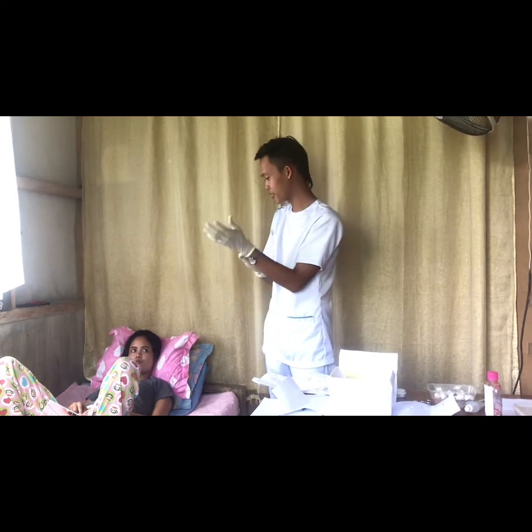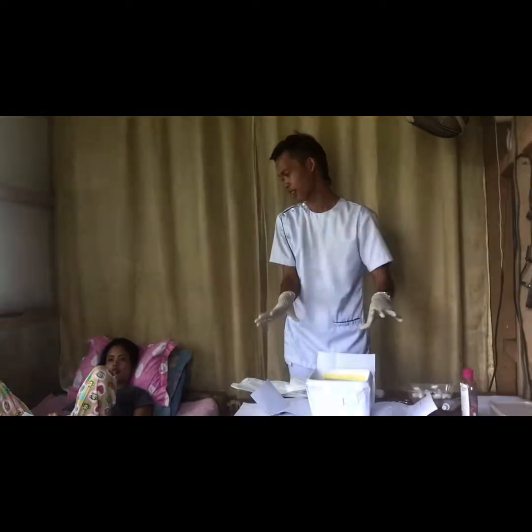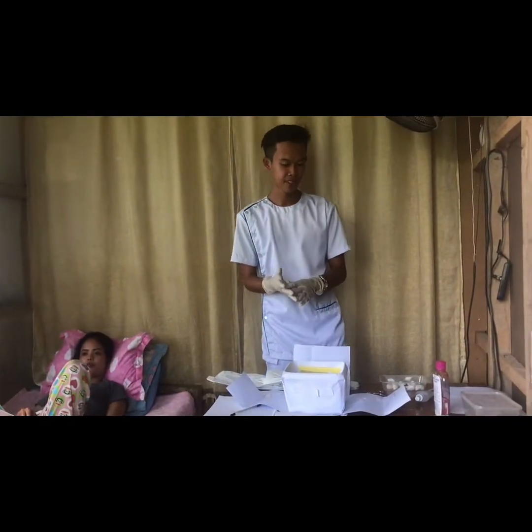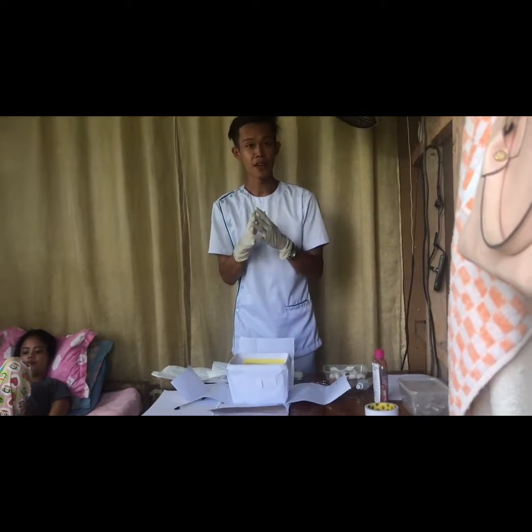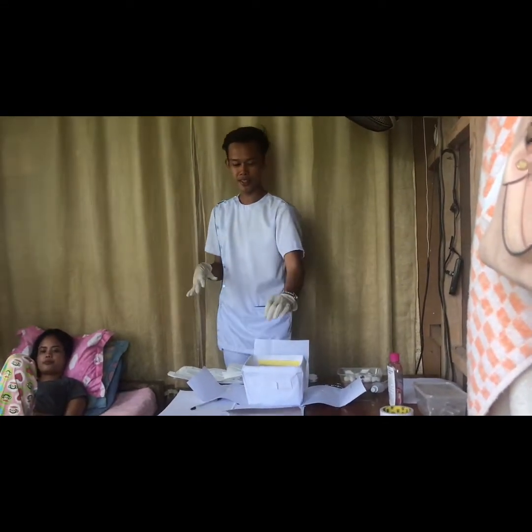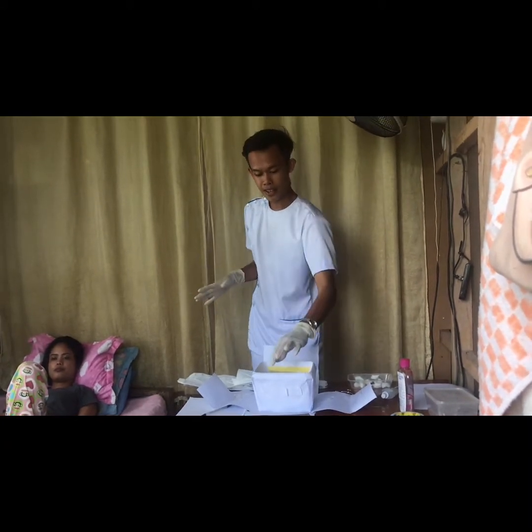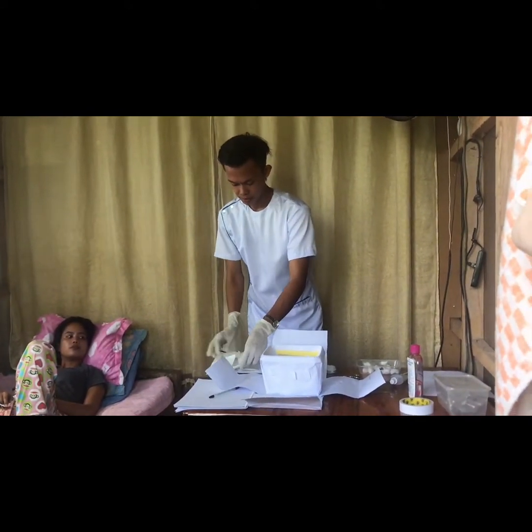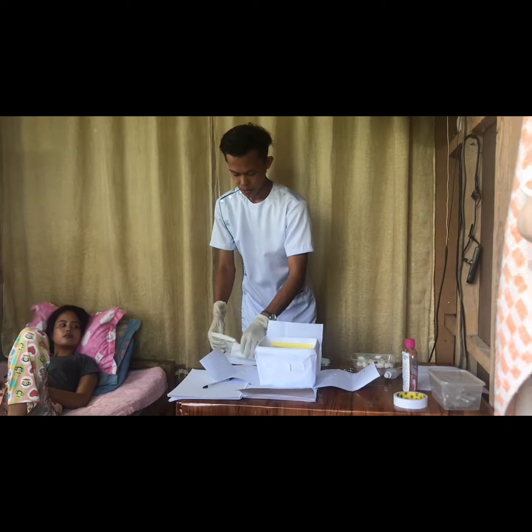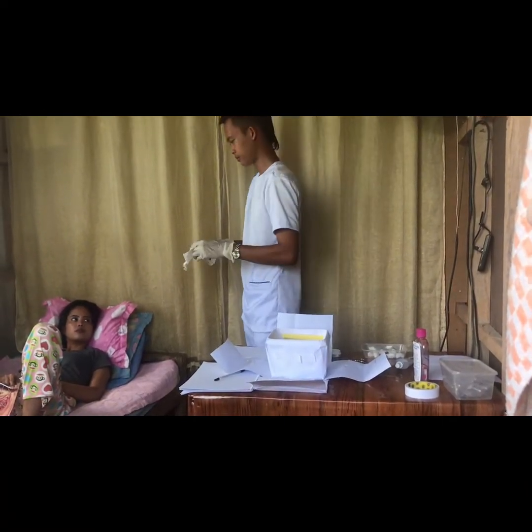I'm just wearing the sterile gloves because I'm going to handle the catheter kit, which is sterile. Okay. So as you can see, the catheter kit itself is now exposed, so I am now able to handle all of the equipment inside the kit. So the first item that I'm going to pick up is the drape. So before that, I'm going to place this in the trash can to keep the surrounding clean.